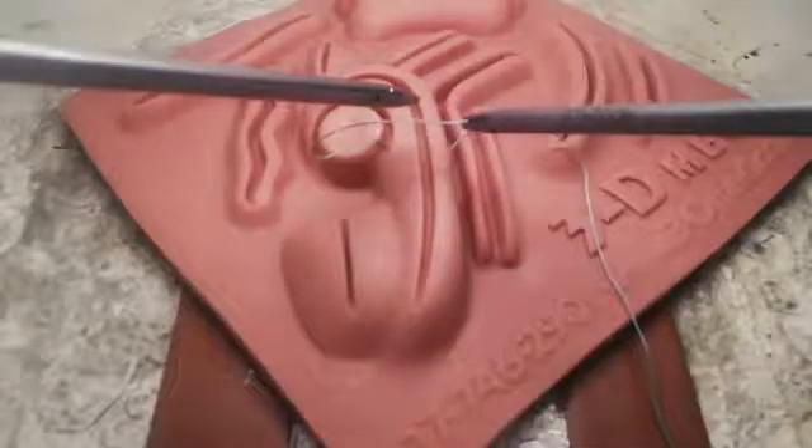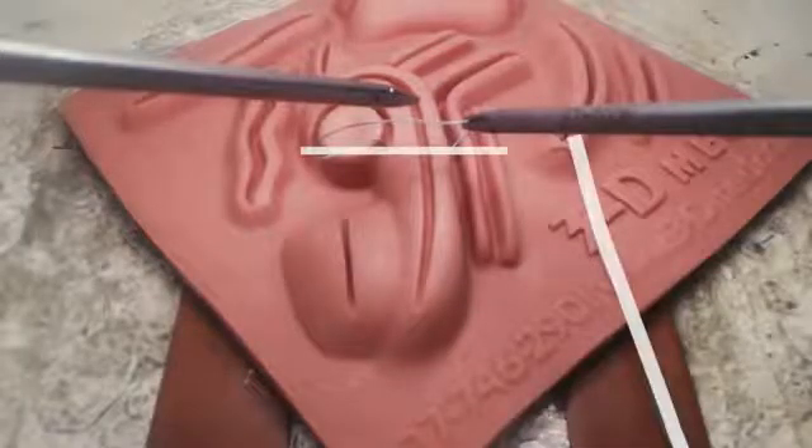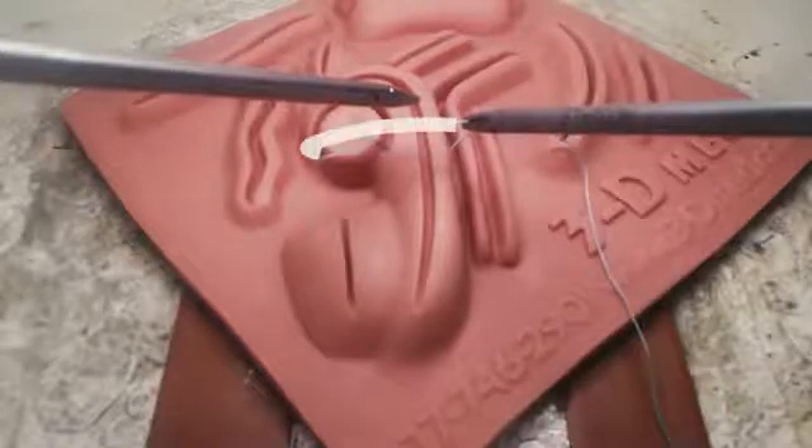Here you can see how you should be setting up for tying when the needle end of your suture is below the equator. You'll start with your tying instrument above the loop.